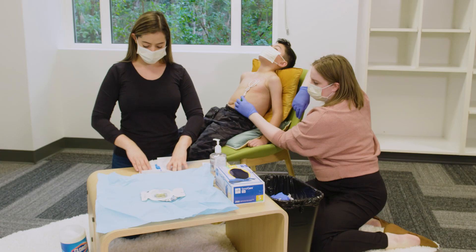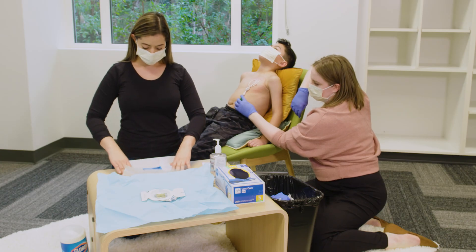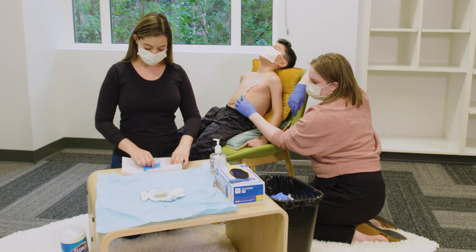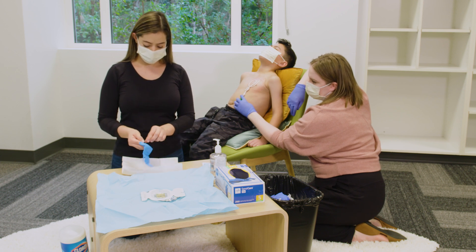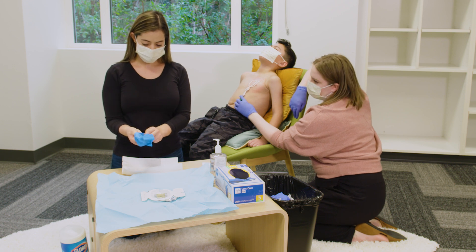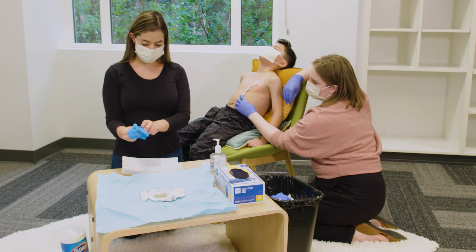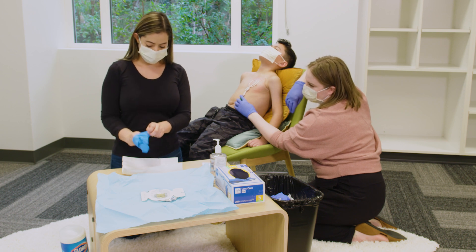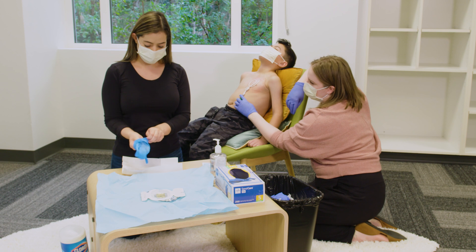Putting on sterile gloves. Start by opening the sterile glove packet like a book. Use your non-dominant hand and pick up the glove for your dominant hand by the cuff, being careful to only touch the inside of the glove. Let the glove hang with the fingers pointing downward and slide your dominant hand into the glove. If the gloves do not go on straight, wait to adjust them until both of your hands are gloved.